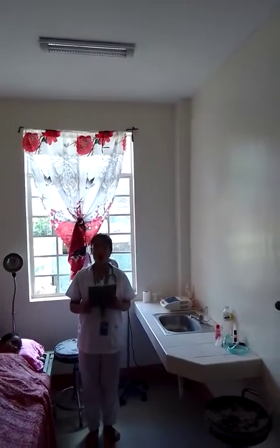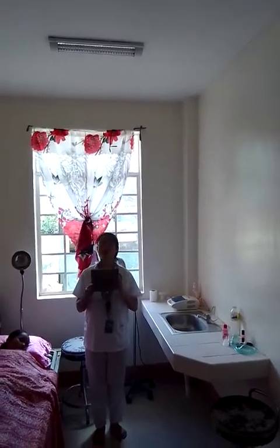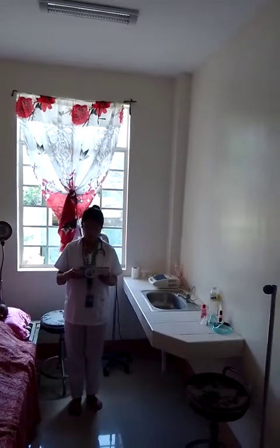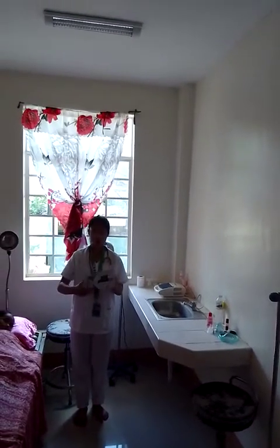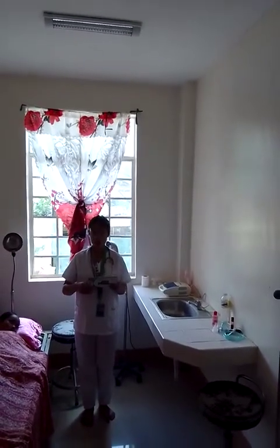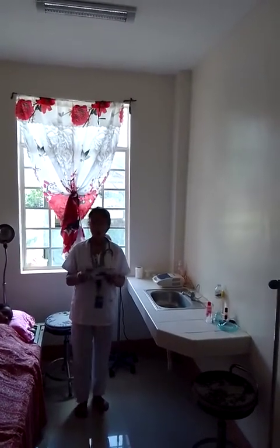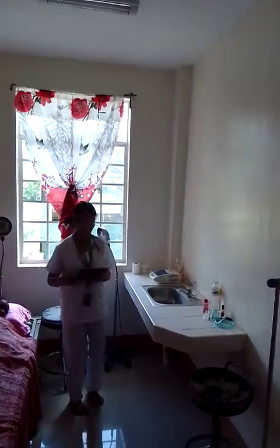Okay. The next thing that we need to do is check the card against the doctor's order sheet, Cardex, and medication sheet. Okay, since that is already checked, let's proceed to the next step.